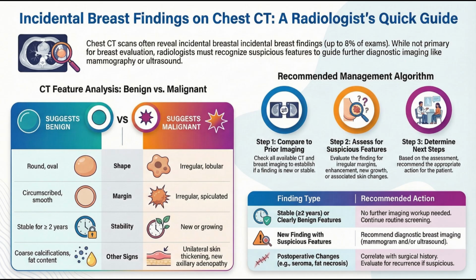Now, we usually think of density as a mammogram finding, but the source material made a really interesting point about CT. Yeah, this is fascinating. Studies have shown that CT is perfectly good at assessing breast density. The assessments are very consistent with mammography.